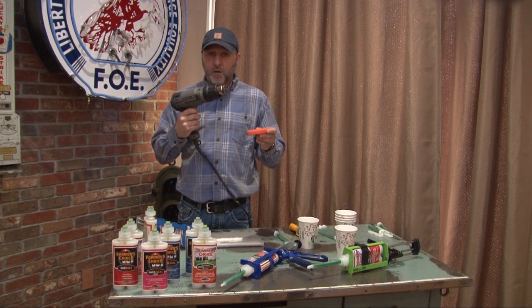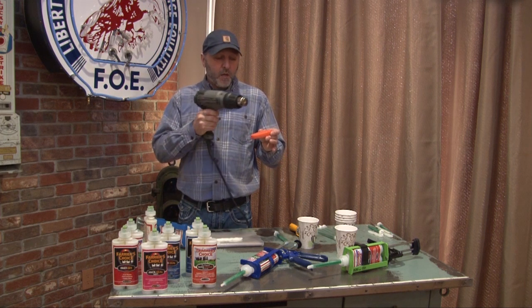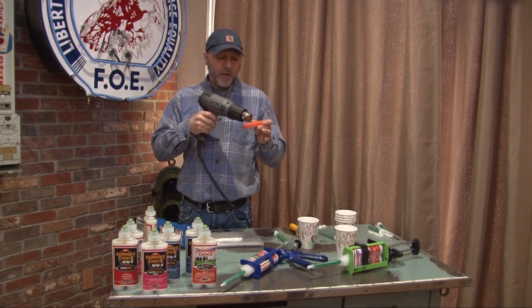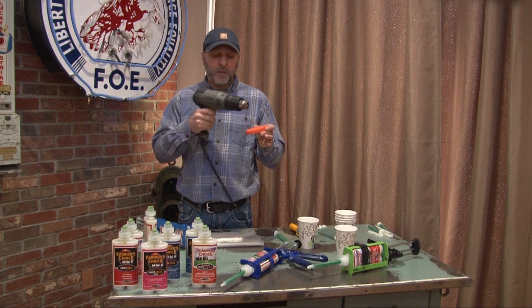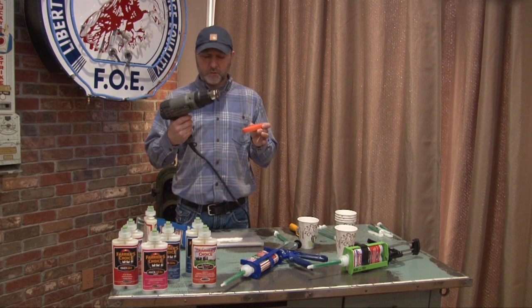But the key for the heat gun also is, when you apply that block and you set it on that cow, simply turn your heat gun on and warm up that area around the block. Just warm that air up to allow that product to not see that 30 degrees, 20 degrees. Allow that heat gun to warm that area up just for the minute or so before that product cures. It's been a huge tip. We found success in it.